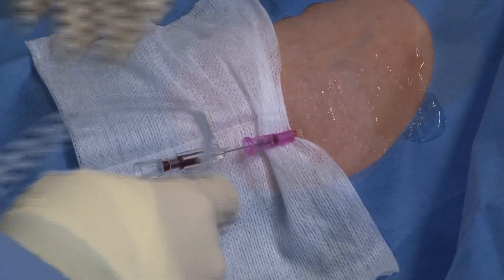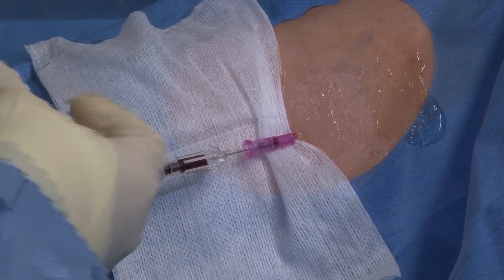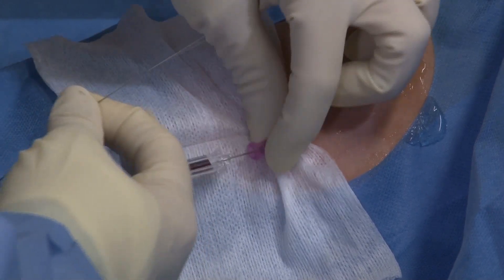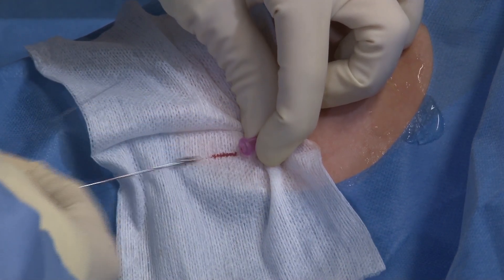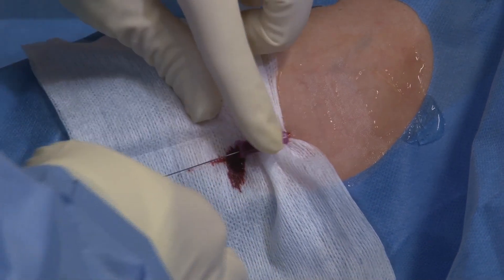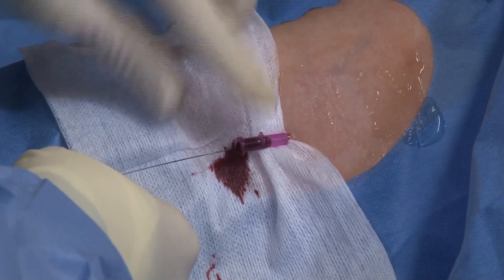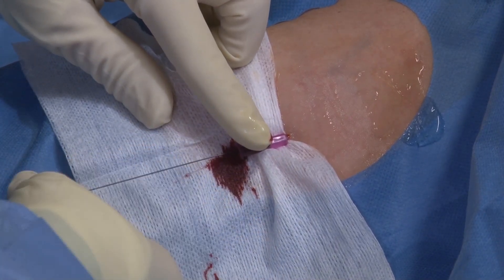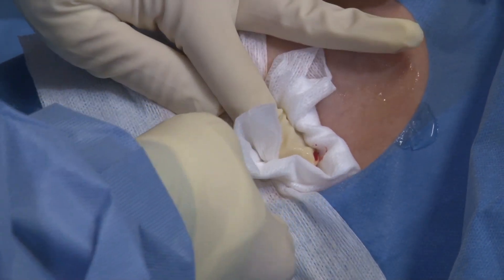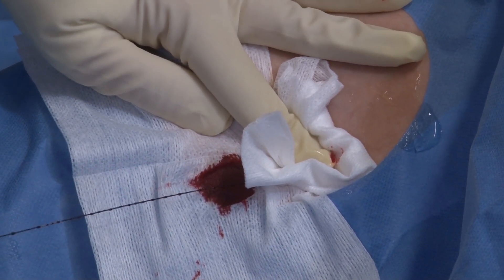Once access is obtained, the guide wire can be advanced into the vessel. The cannula is then removed in preparation for dilation.